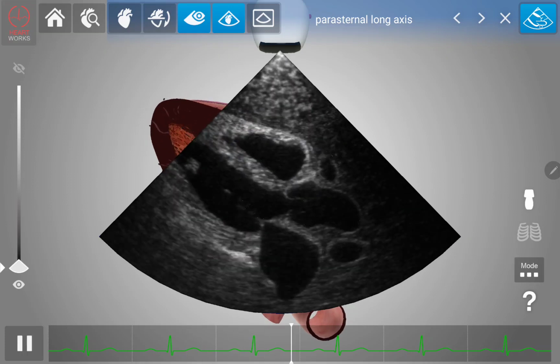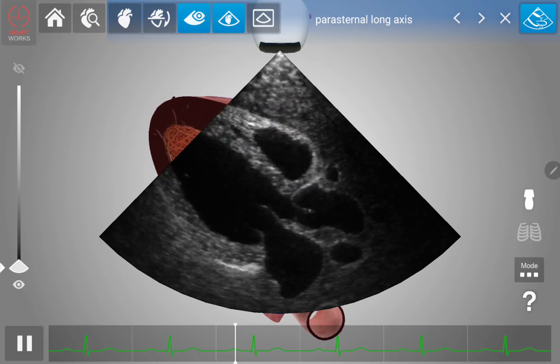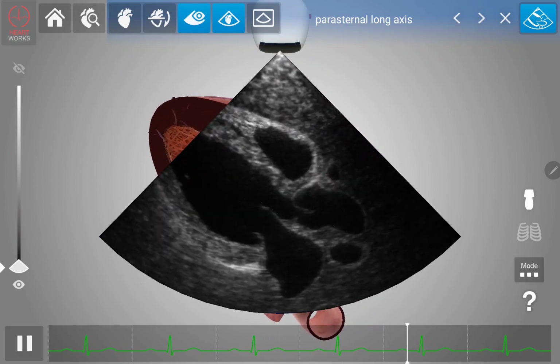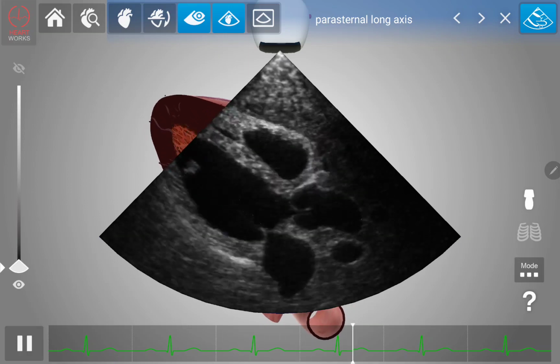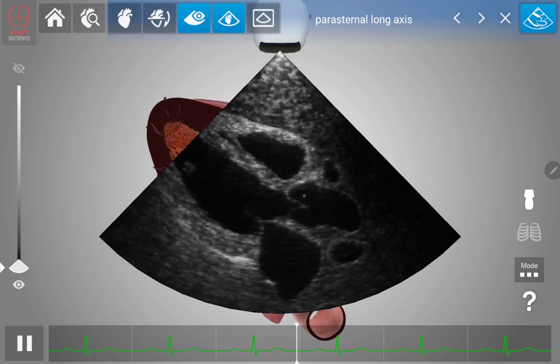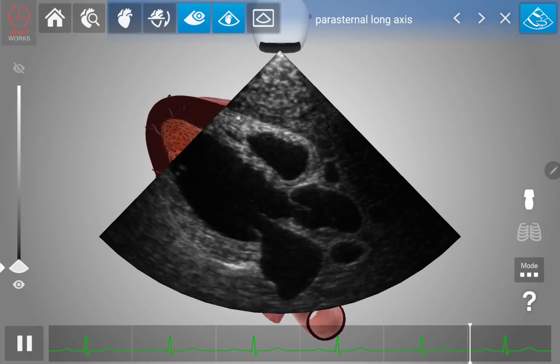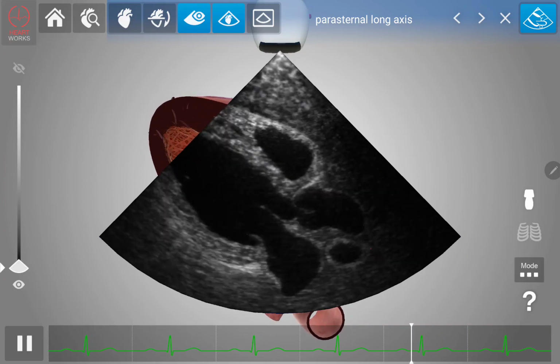So we'll get the image started here again. Going from the left ventricular outflow tract, we see that blood is going to flow through into the aorta through the aortic valve. So we have two cusps that we can see here. We note that the aortic valve is trileaflet, but in this view we can see two of the valve leaflets. The first one is typically the non-coronary cusp, which is here, and the second one is the right coronary cusp. Now this makes sense that this is the right coronary cusp because this is our right ventricle. Okay, so just understanding anatomy is very helpful for you.